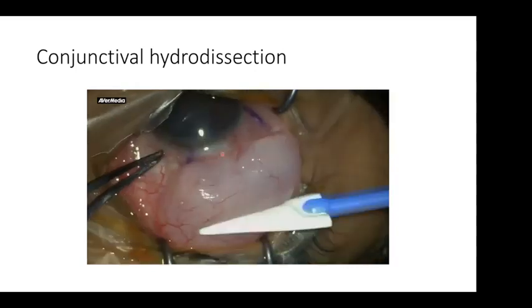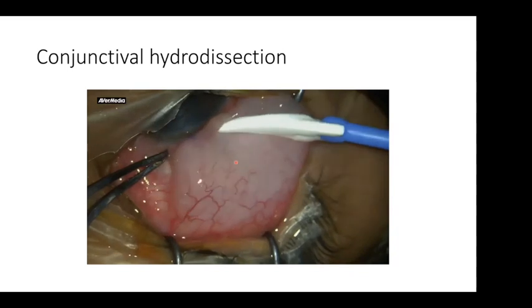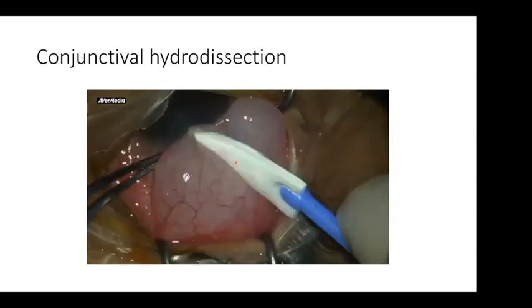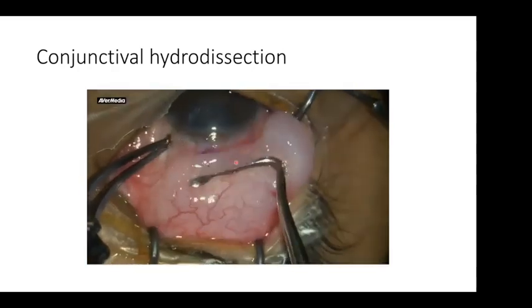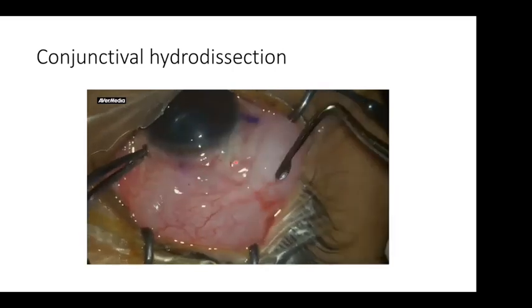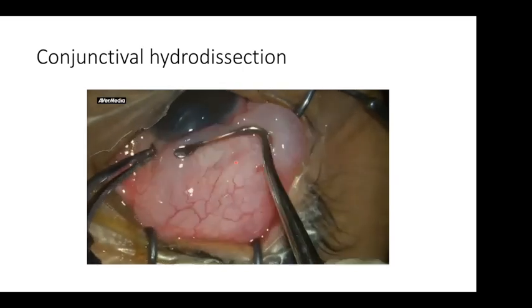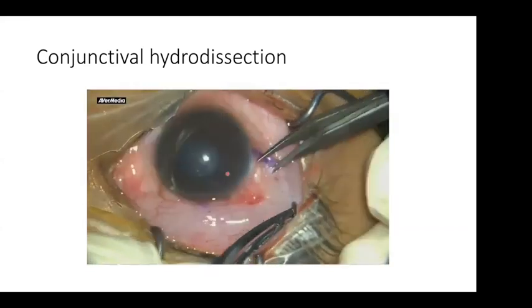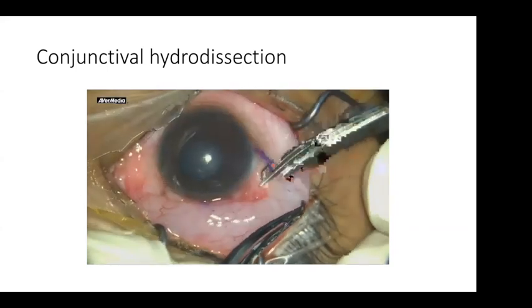It looks like a line of scarring, so I'm trying to push the subconjunctival fluid and subtenon's fluid mechanically to try to get more and to create more of the subconjunctival space. I'm using the hook as well to try to get more of the conjunctiva anterior, because I don't want to cut the conjunctiva so much away from the limbus. So again, I thought now I'm relatively in a better position. And then when I cut at that time, I make sure that I'm cutting towards the cornea.